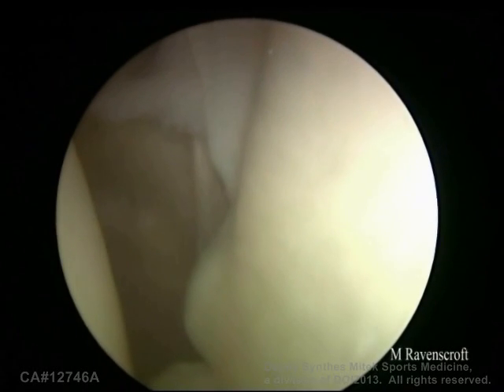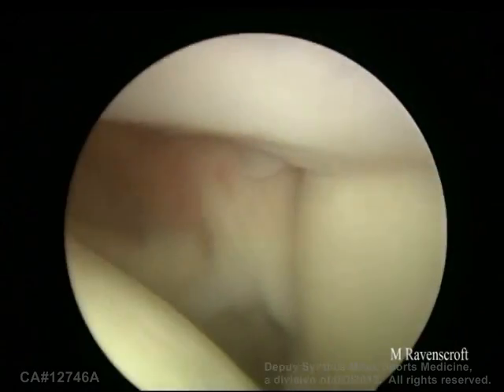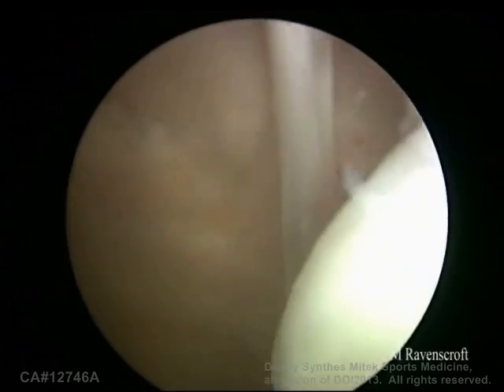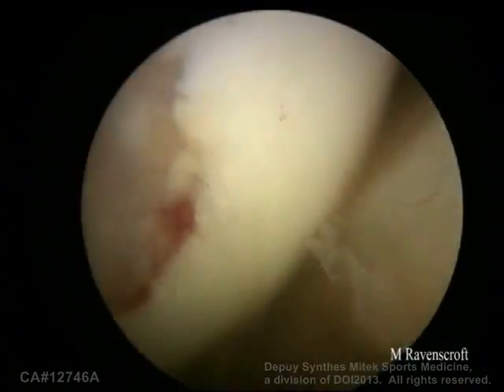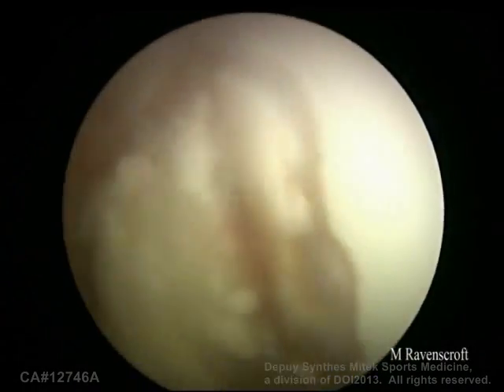This is a video of an arthroscopic Latarjet by Matt Ravenscroft. This is a left shoulder viewing from the posterior port. The cuffs are intact and the biceps are intact. You can see there's a lot of bone loss anteriorly and a very large Hill-Sachs which does engage.